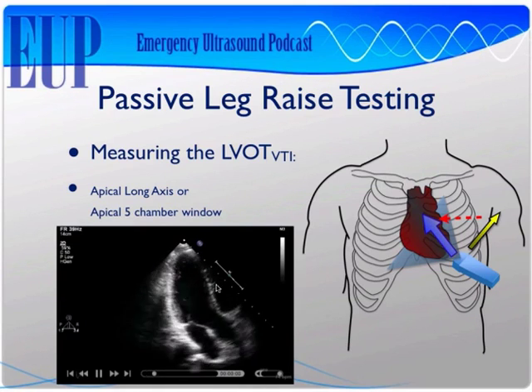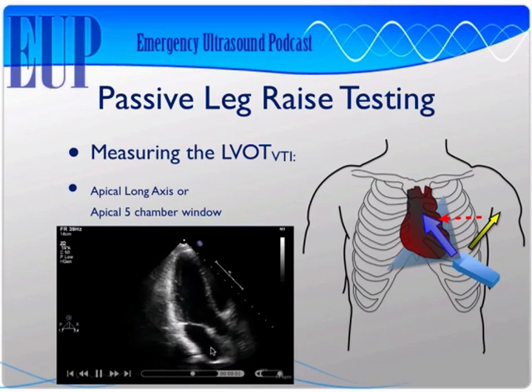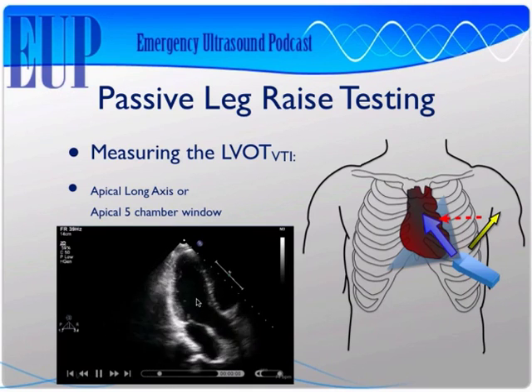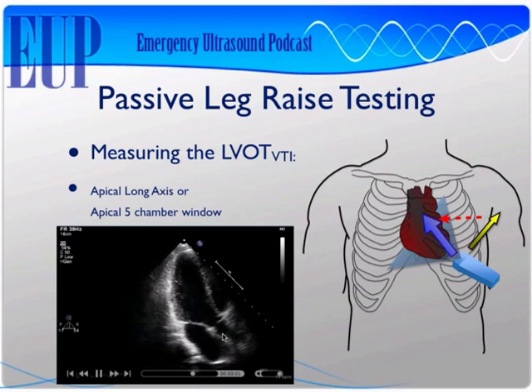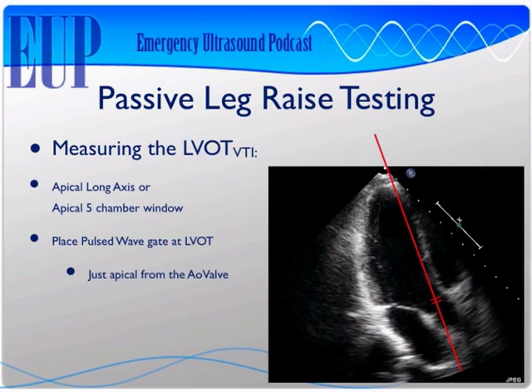window. This is an example of the apical long axis window, where we're looking at the left ventricle here, the left atrium here, and then here's that left ventricular outflow tract. This is where all the blood is going during our systolic ejection period. It's going through that aortic valve right there, and here's where I'd put my pulse wave Doppler. If we stop that image, you can see we have the pulse wave Doppler gate right in the left ventricular outflow tract area, and this is where we measure the VTI.